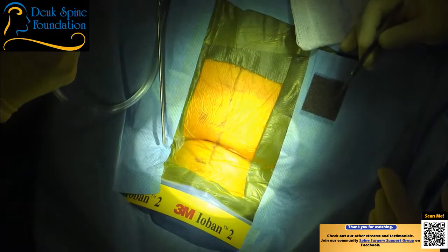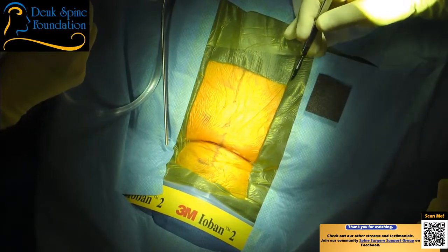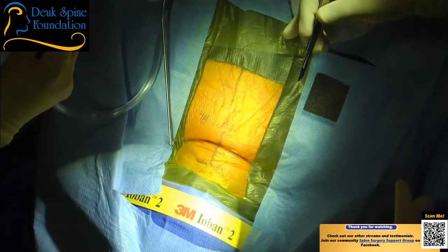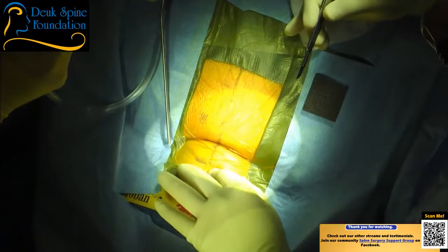We have a guest today, Dr. Atwater, who will be observing. Are we ready? We are ready. We've already done our timeouts, and we're going to get started. Sir, are you ready, Dr. Fu? Yeah. Okay, we're going to make our skin incision.